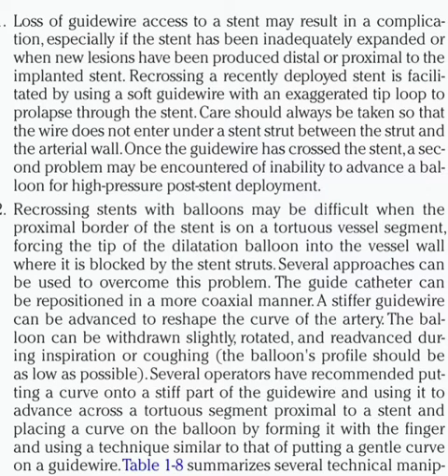Several operators have recommended putting a curve onto a stiff part of the guidewire and using it to advance across a tortuous segment proximal to a stent, and placing a curve on the balloon by forming it with the finger, using a technique similar to that of putting a gentle curve on a guidewire.